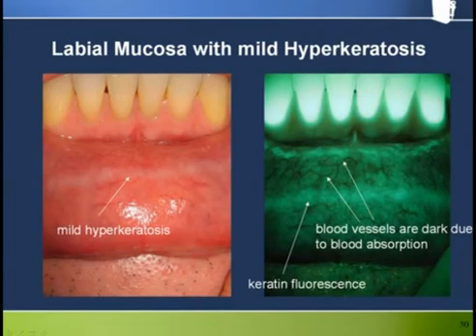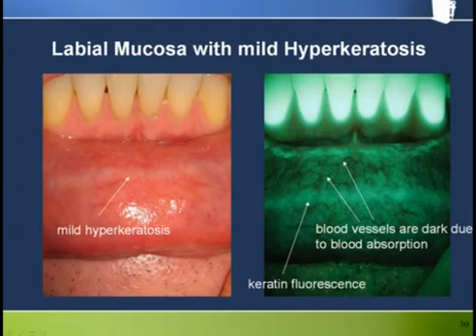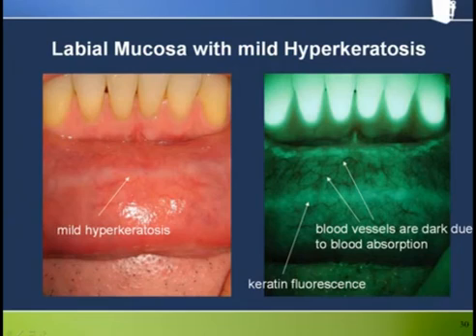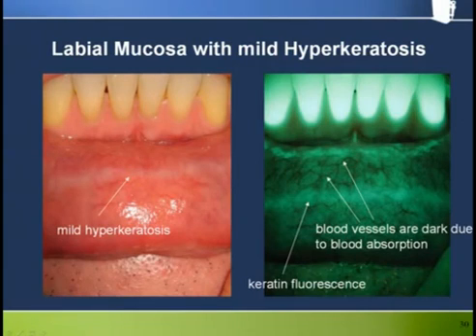An analogous phenomenon to linea alba on the buccal mucosa can occur on the labial mucosa due to irritation from the front teeth. In this case we see classic mature non-inflamed hyperkeratosis, which appears brighter under Velscope due to keratin fluorescence. Note also how well the dense collections of blood vessels can be visualized under fluorescence due to loss of fluorescence from blood absorption.